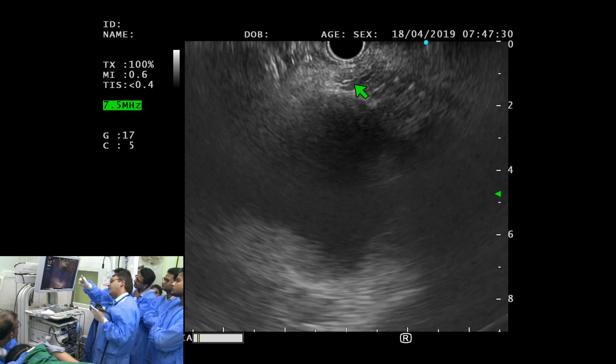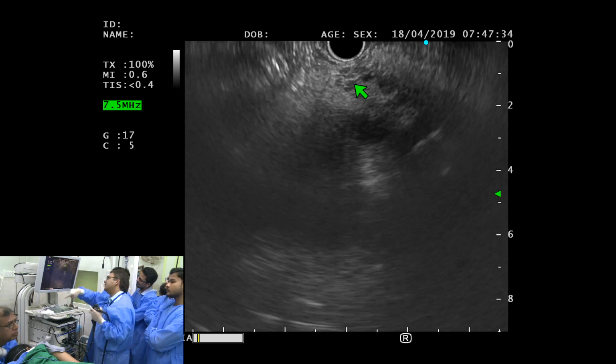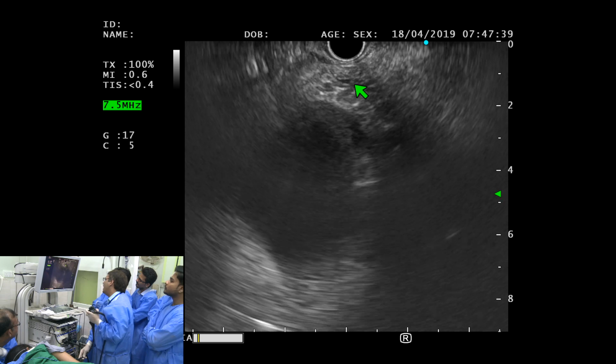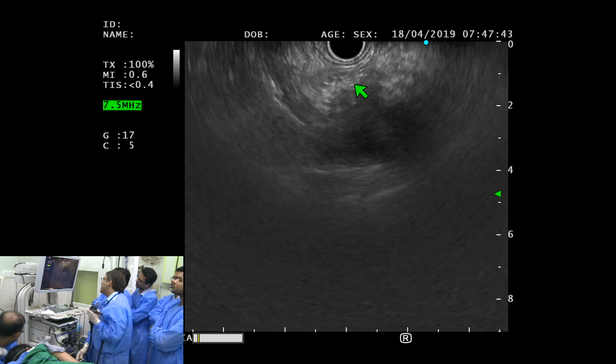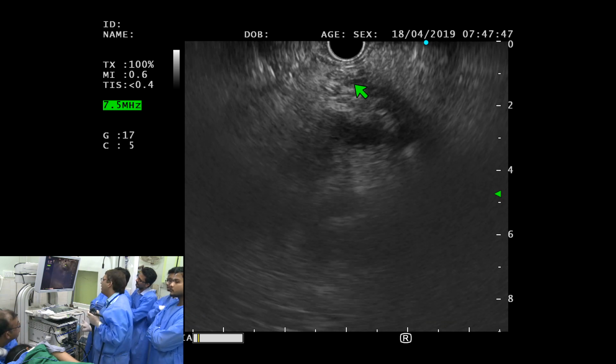What I meant is that fibrous tissue around the normal pancreas makes lobules, and they can look a little bit hypoechoic. Khalid, in our experience, the Pakistani pancreas is a little more hypoechoic than usual. We've gone through so many. Yeah, we have talked about that before.